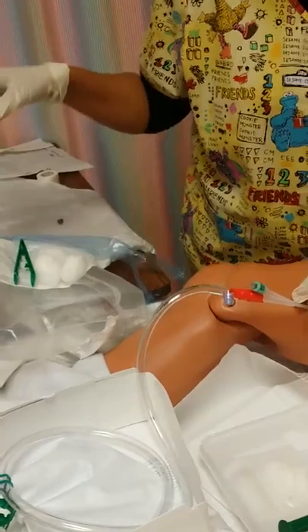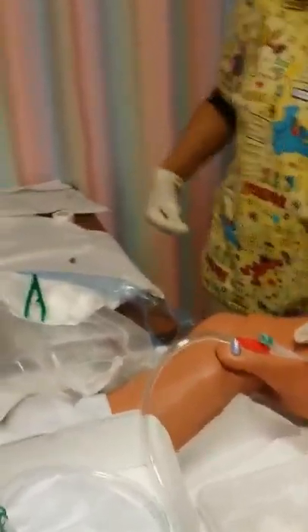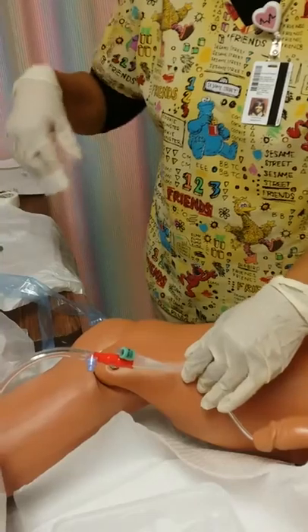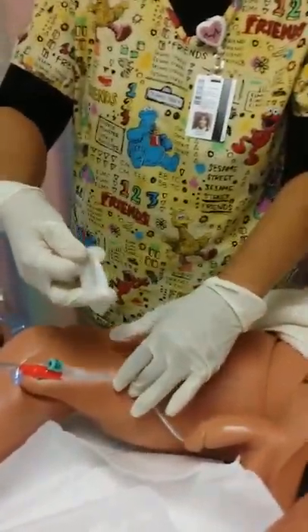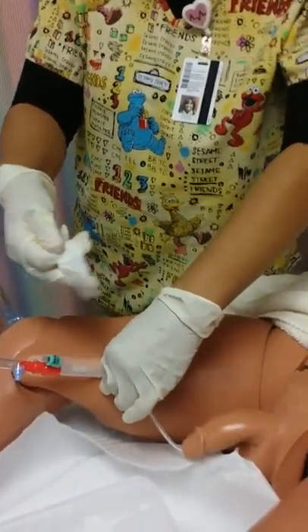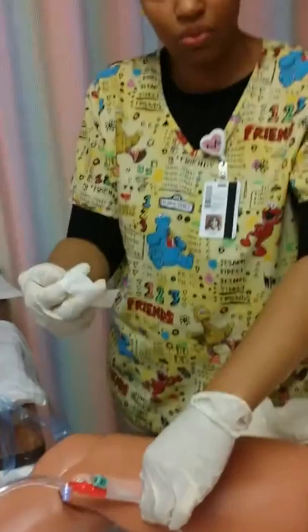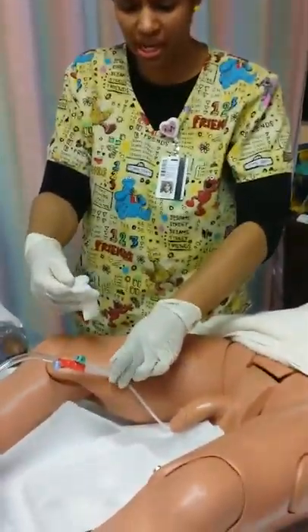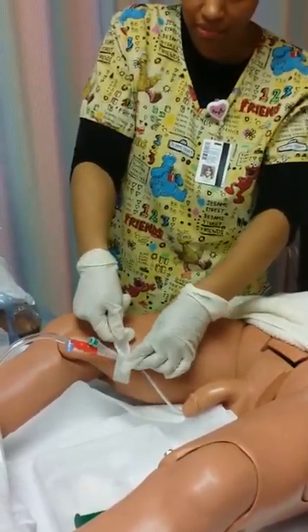Okay, just want to do that. And so tape. Normally I would have it in a closer area, but this is a simulation here. So I'm going to go ahead and ensure that there's some slack for the patient, so if he moves a little bit, it won't cause him any pain or discomfort or anything like that. So I'm going to go ahead and secure it to his leg.